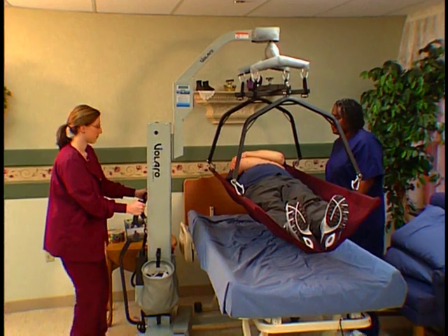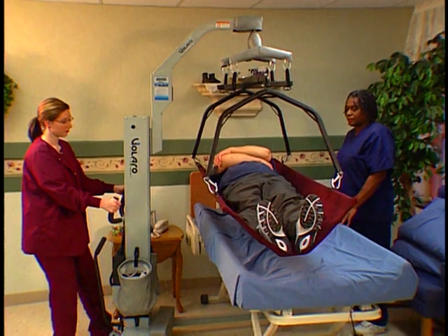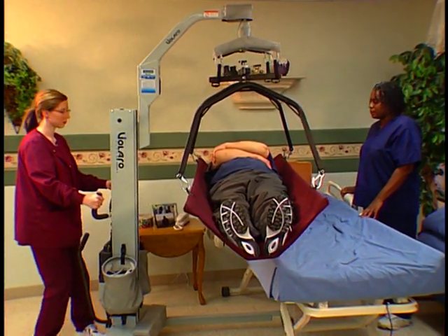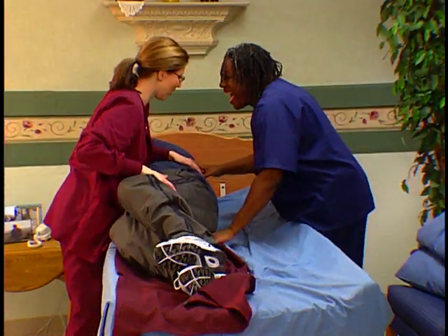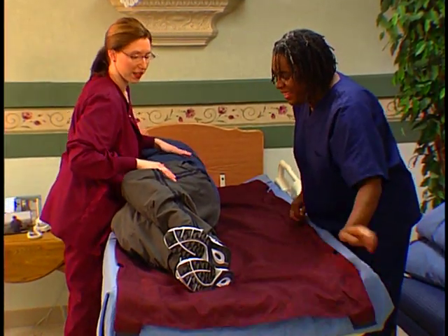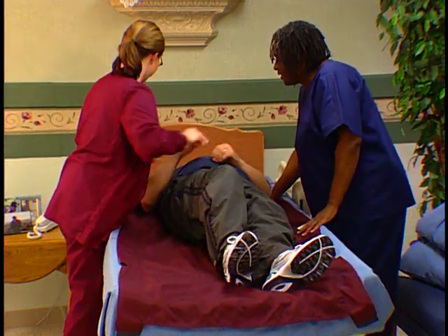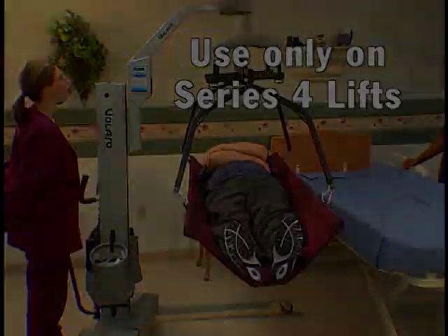Stretcher attachment. The stretcher attachment is used to transfer patients from bed to gurney. It is also convenient for lifting and weighing patients without having to flex their bodies into a sitting position. If you'll be using the stretcher attachment, please be sure to consult with the patient's healthcare provider for proper patient positioning and transport. The stretcher system is designed to be used on Volaro Series 4 lifts only.